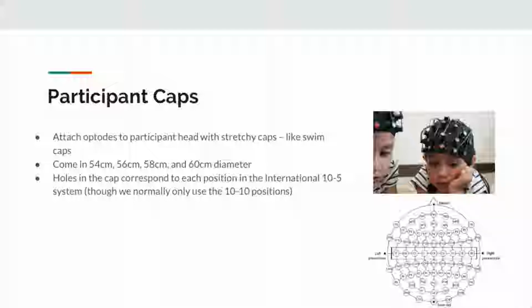External locations don't map super well to internal locations, and internal locations are very variable, rehashing what Ryan's question was yesterday. But it's the best option we have for positioning fNIRS, and like I mentioned yesterday, there are methods for improving that positioning and even matching it to internal structures if you want to go the full 10 yards of getting an MRI structural scan, putting a vitamin E caplet on someone's head while they're in the MRI, and then you know exactly where their external landmarks are relative to their internal landmarks.